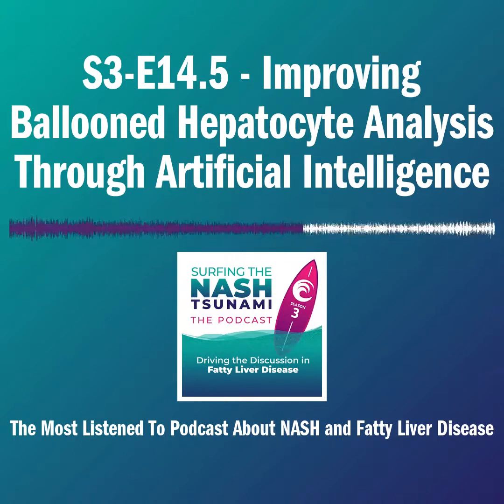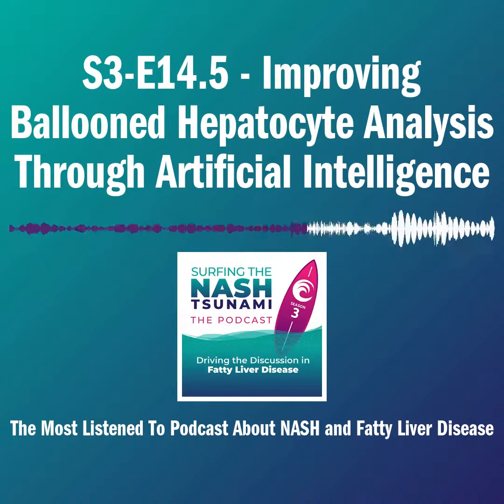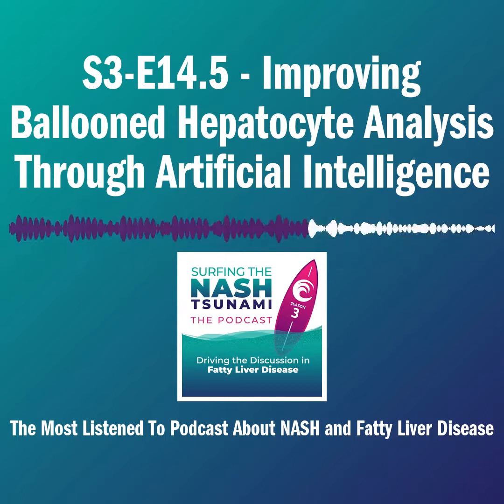When we used each feature of machine learning, like the septa or nodules or fibrosis separately, they did correlate well with portal hypertension as well as clinically significant portal hypertension. However, when you put the septa, nodules, and fibrosis features together in a score, that was very reliable in detecting portal hypertension, clinically significant portal hypertension, with an area under the curve of 0.85, and in the validation cohort of 0.74.